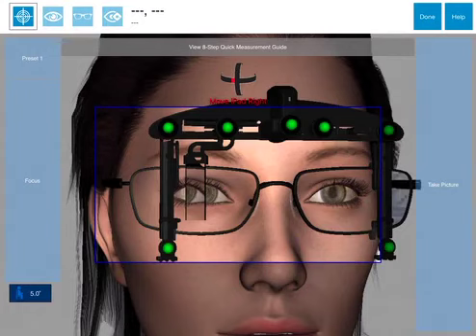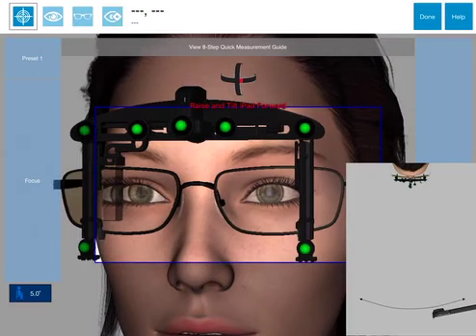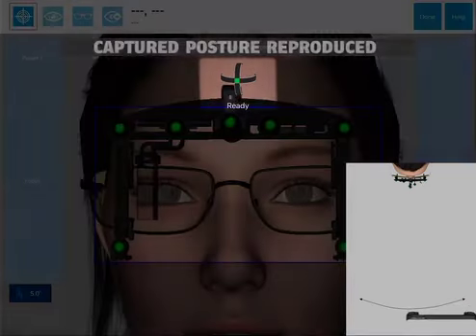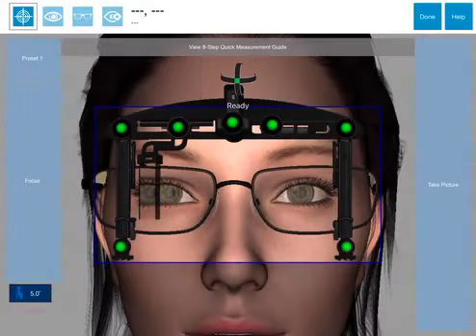Follow the on-screen indicator and either adjust the iPad position using a pivoting motion or simply ask the customer to raise and lower their chin and rotate their head accordingly. The measurement image does not need to be taken at the customer's eye level.